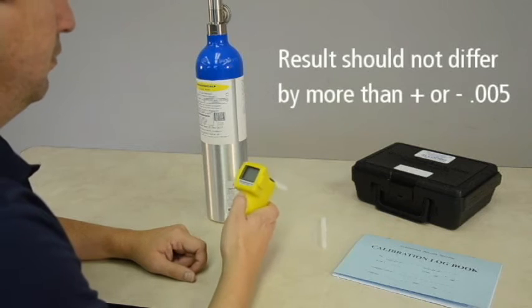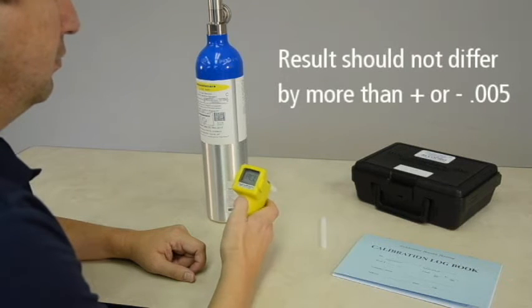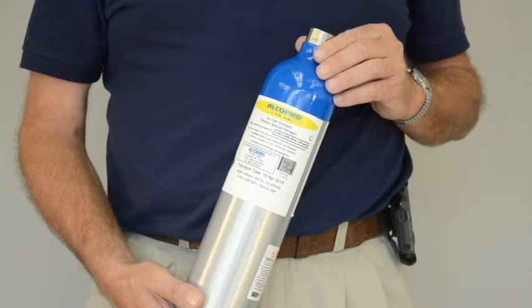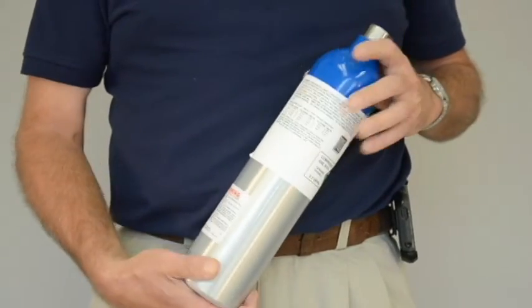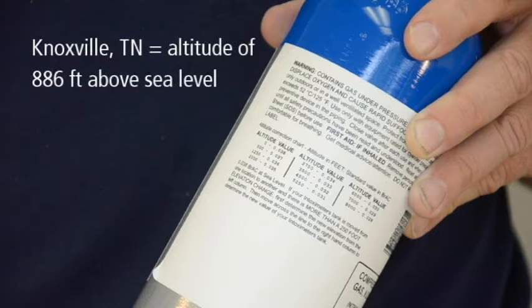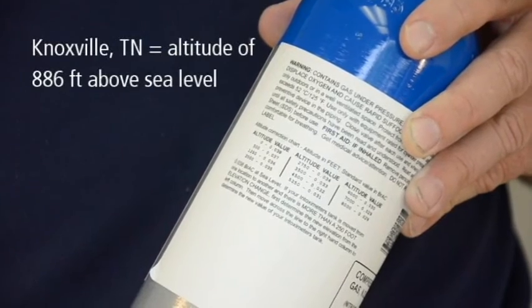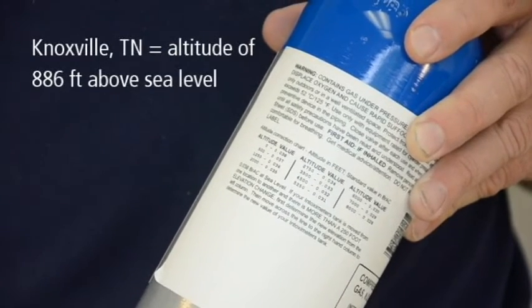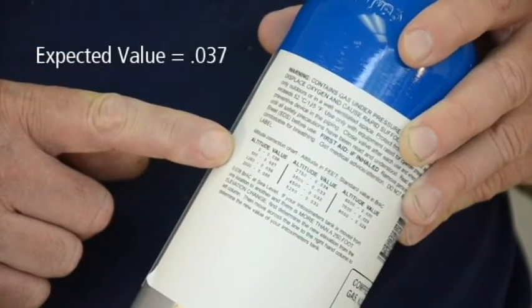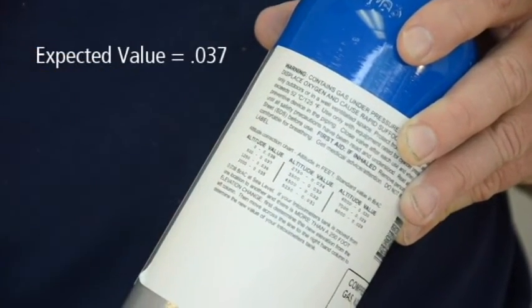The result of your accuracy checks should not differ by more than plus or minus .005 from the expected value of the standard gas sample. The expected or target value of your gas standard can be derived by referencing the altitude chart on the back of your tank. For example, if you are performing an accuracy check in Knoxville, Tennessee, which has an altitude of 886 feet above sea level, the altitude chart shows the expected value of the alcohol gas tank to be .037.